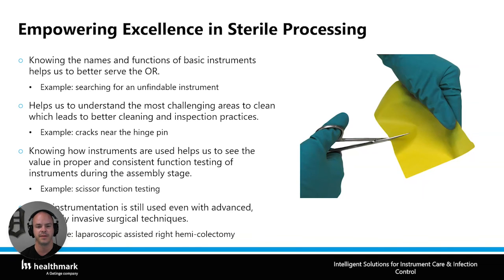The other thing is we also need to protect these expensive assets. Surgical instruments are very expensive, very costly assets that the hospital invests in. So we also need to maintain them. We also need to send them maybe for repair. We might have to replace them when they come to end of life, or when maybe there's damage involved and they could be risky to be used on a patient. So all of that is helped when we understand basic instruments.